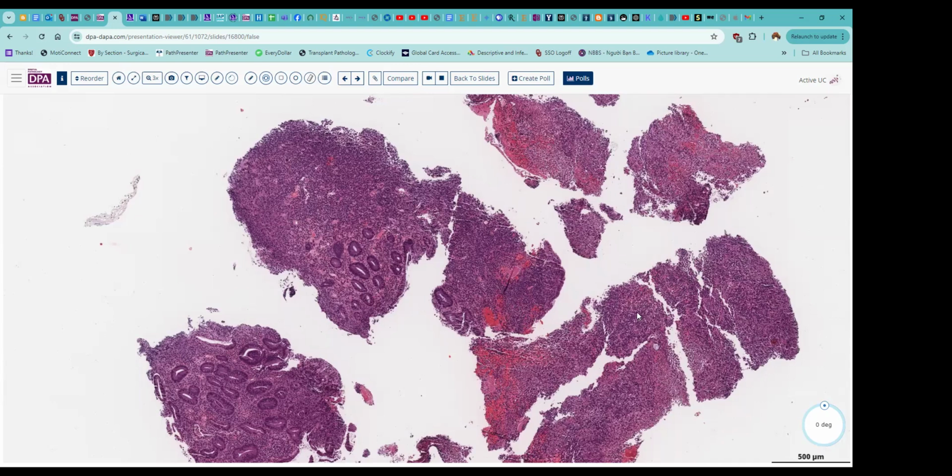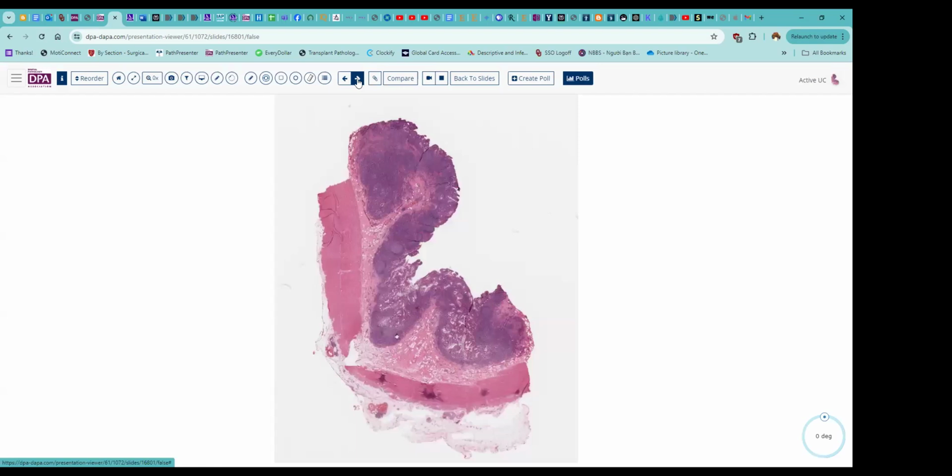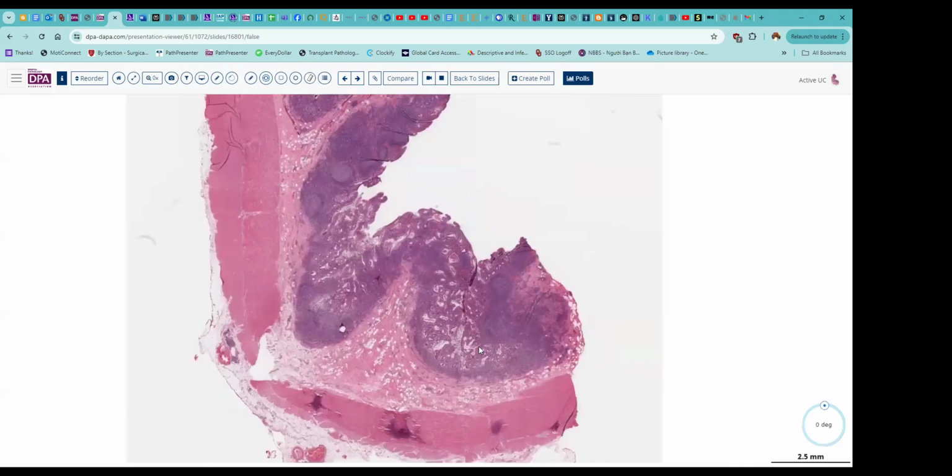The clinician can then, based on what they've seen in terms of distribution, other symptoms and so forth, determine whether that's going to be more likely Crohn's disease, ulcerative colitis, or indeterminate colitis if they're having difficulty making that distinction. So I thought we'd do a few resection samples, which also show examples of some of the findings that we can see. This gives us a broader range of options.